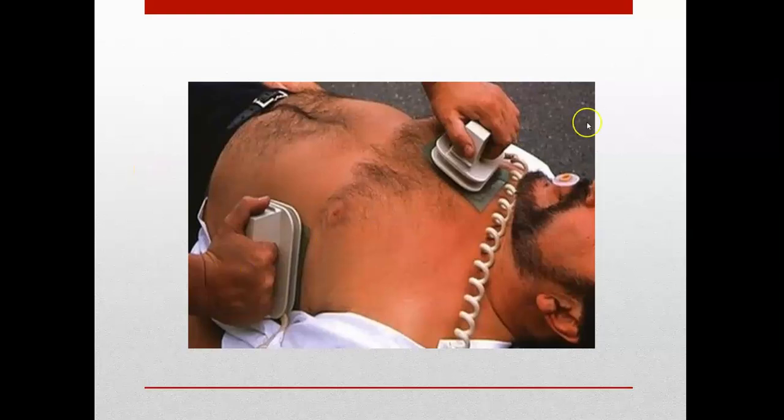All right, so this is just an example. It's an older picture of the paddles that we see, and it had the gel pad medium. Sometimes it was actual gel, sometimes it was gel pads like this. Really in patients who have really hairy chests, so your guys typically, the pads may be a little bit harder to stick to them if you have time. A lot of times you don't.